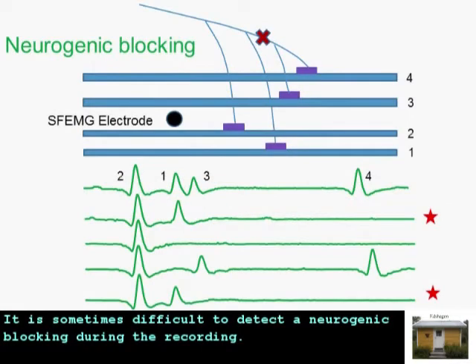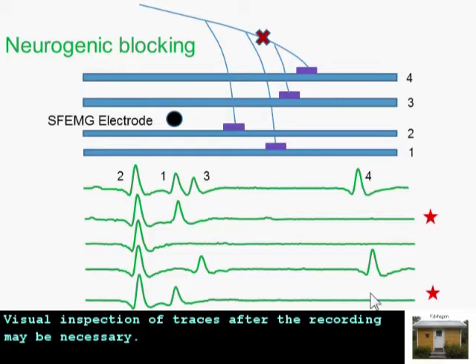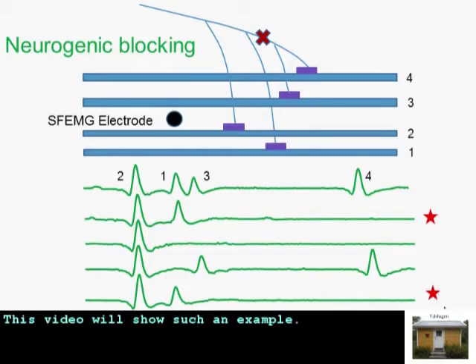It is sometimes difficult to detect neurogenic blocking during the recording. Visual inspection of traces after the recording may be necessary. This will show such an example.